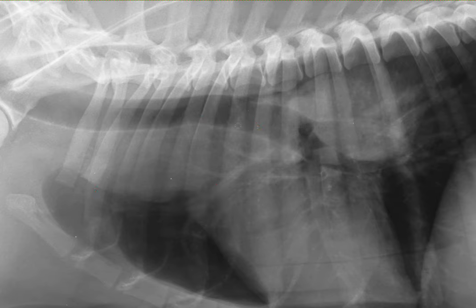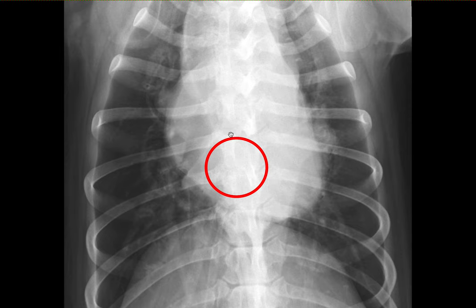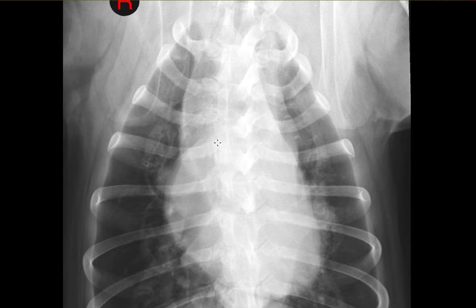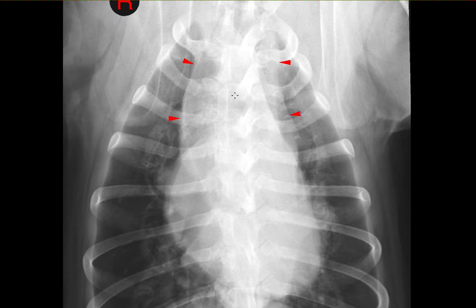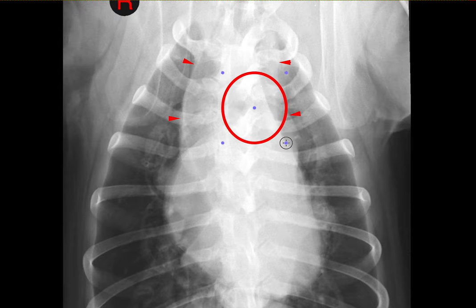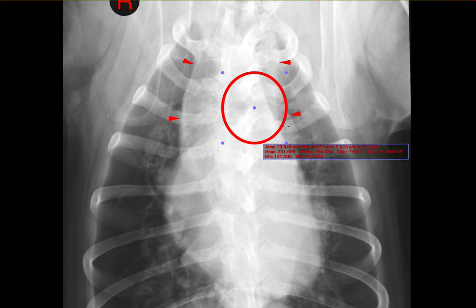If we look at the dorsoventral view, you may be able to notice that lesion. You can see that the mediastinum is actually widened, and it measures probably over three times the width of a vertebral body. If you look at the trachea, it is severely pushed to the right, indicating a mass effect, probably due to a structure being located to the left.